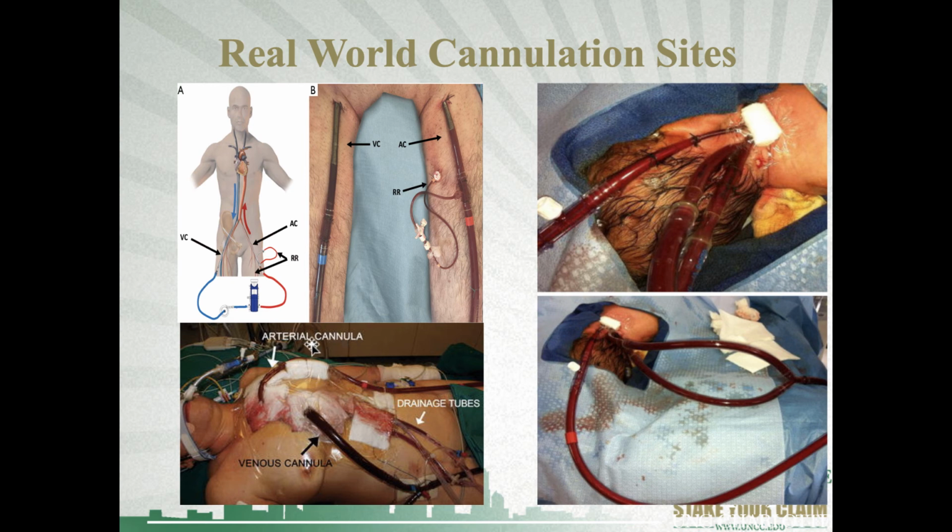Now here is an example of what you would see with your central cannulation. So a whole lot of nothing.